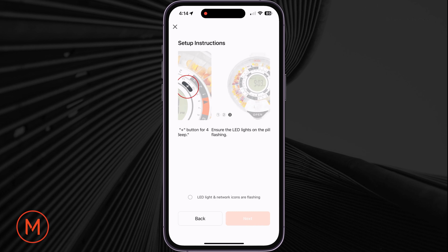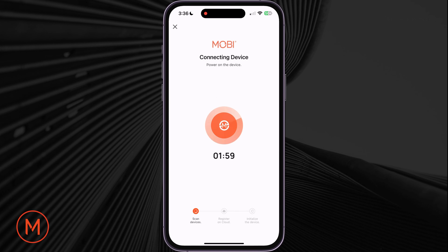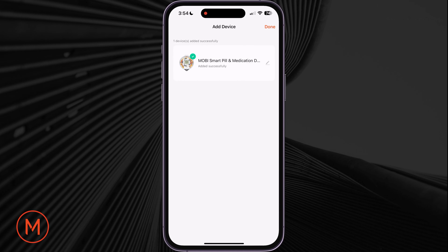Third, after hearing the beep, ensure that the pill dispenser's light is flashing. Once flashing, tap on LED light and network icons are flashing, then tap on Next. A two-minute timer will begin. Allow a short period of time for the pill dispenser to connect. Once connected, hit Done on the top right corner.